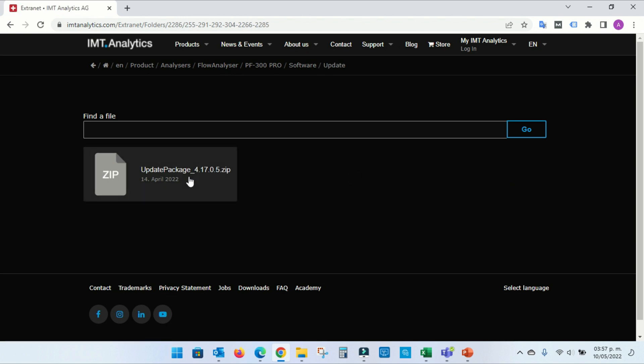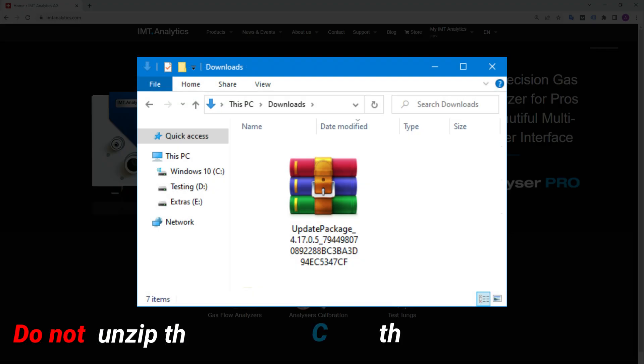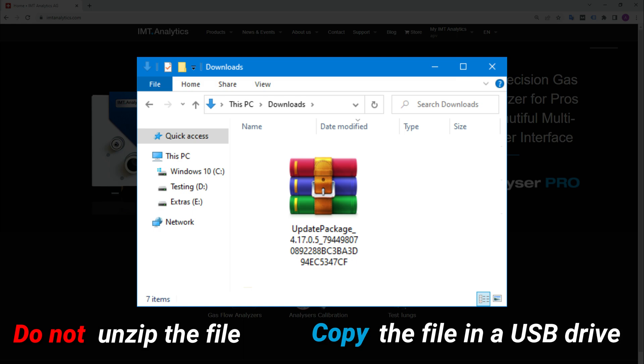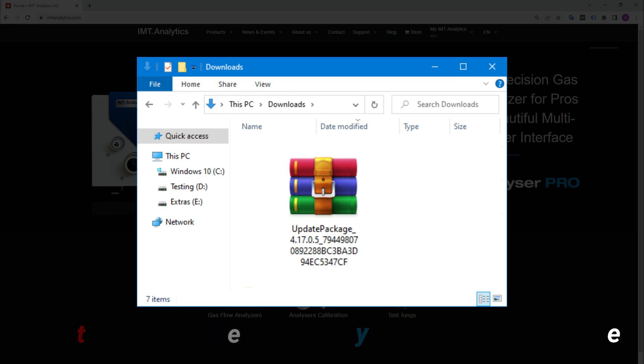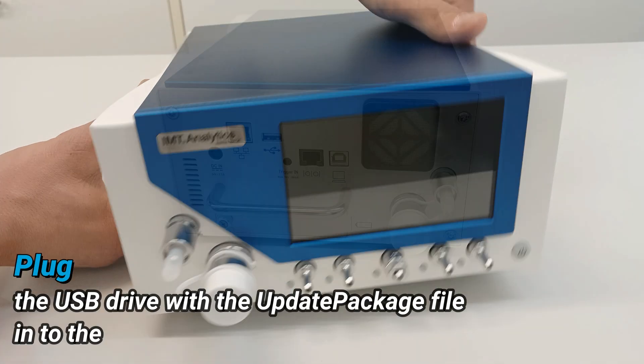Click the Update Package to download the file to your computer. Do not unzip the file. Copy the file to an empty USB drive.